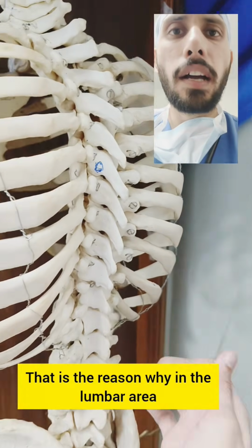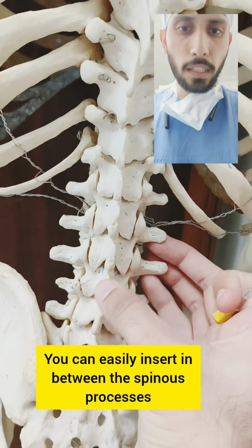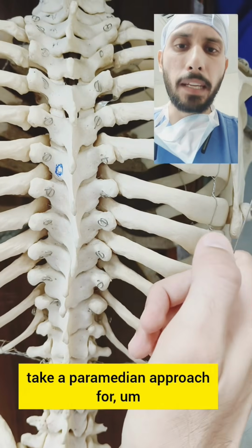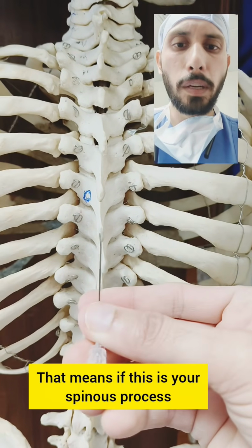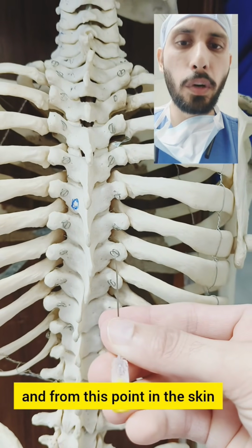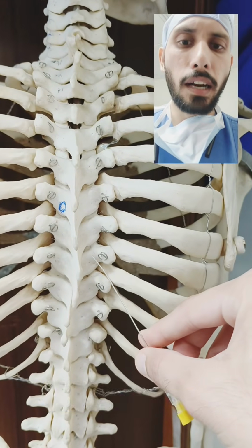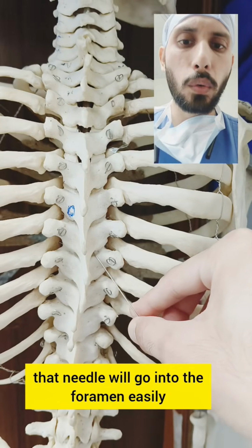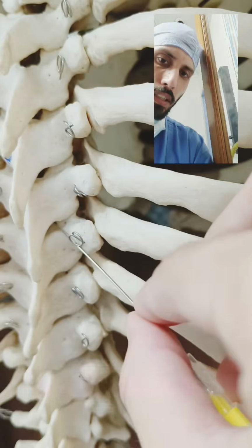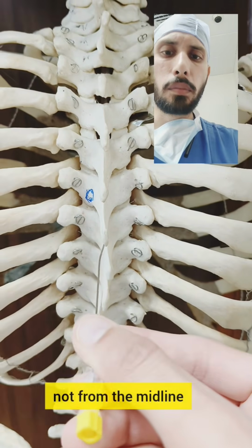That is the reason why in the lumbar area we can follow a midline approach. You can easily insert in between these spinous processes, whereas in the thoracic area you have to take a paramedian approach for ease of insertion. That means if this is your spinous process, you palpate the spinous process, you go 1 centimeter lateral and 1 centimeter below, and from this point on the skin you keep your needle medially directed and cephalad directed. That way, if you insert, that needle will go into the foramen easily. So if I show you laterally, you can see this space can be easily approached through this paramedian approach in the thoracic area, not from the midline.